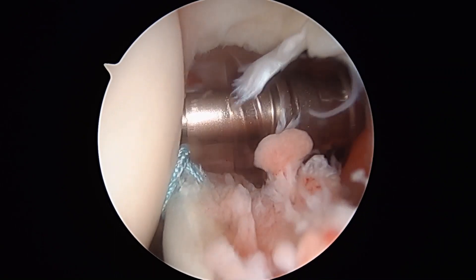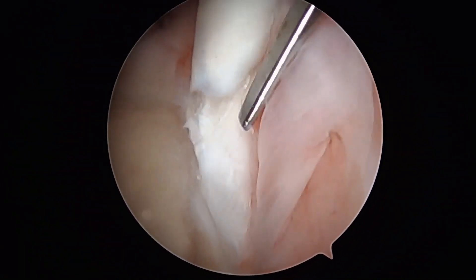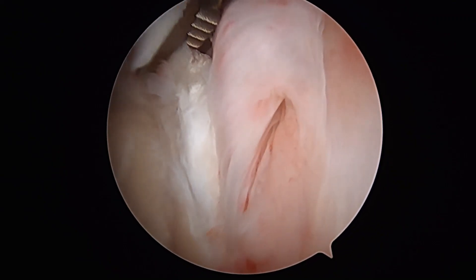Once the anchor is seated, the handle is extracted. Arthroscopic scissors are used to complete a biceps tenotomy at the top of the glenoid.